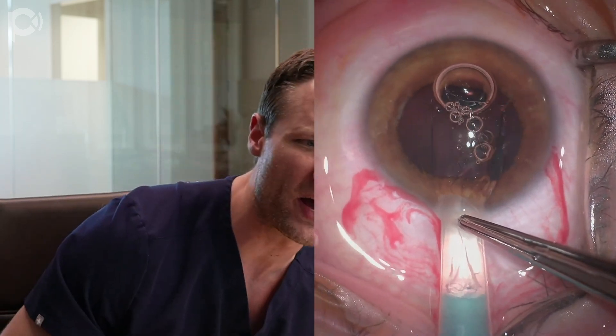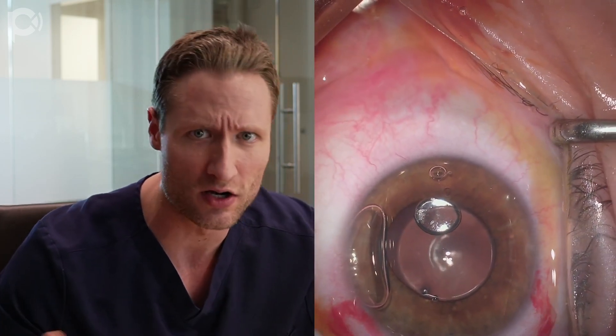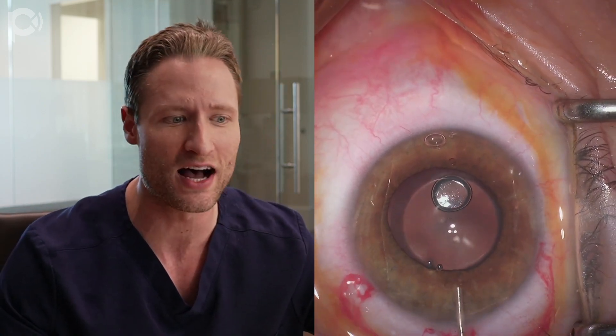Here I am injecting the lens into the eye with no viscoelastic. The bubbles make the view slightly worse but don't really get in the way of the ICL being injected. The lens is delivered into the anterior chamber. I prefer no viscoelastic because if you put viscoelastic in first, you get visco behind the lens that you then have to remove — which is difficult, creates anxiety, and you never know if you've gotten it all out.